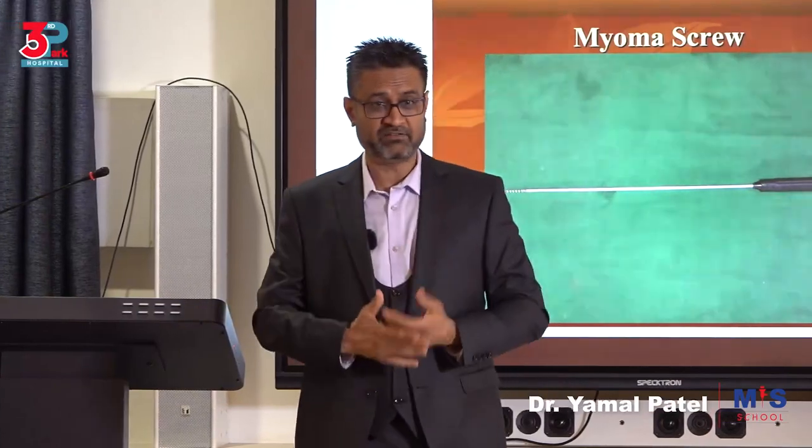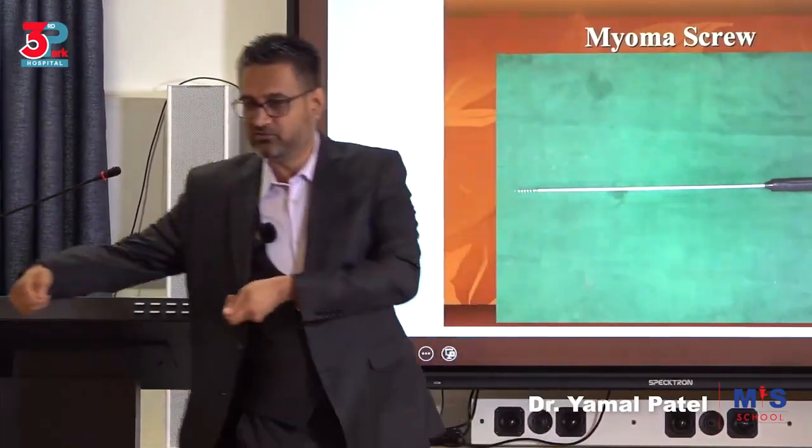I now do ipsilateral suturing. I told you because of my shoulder. When I used to do this across the table, this hand used to get a lot of straining, and I used to do a lot of suturing. I mean, because I do lots and lots of myomectomies, laparoscopic. So when you do very many myomectomies, it requires a lot of suturing, you know that.